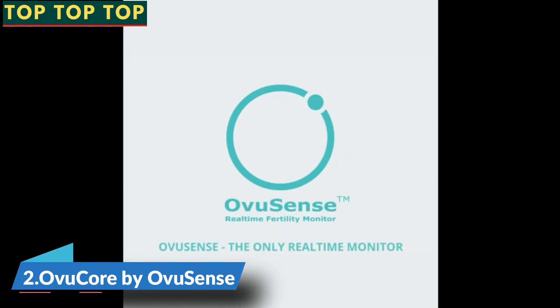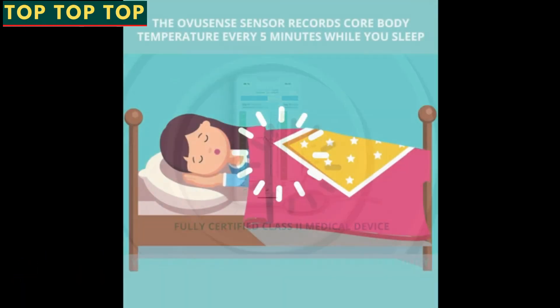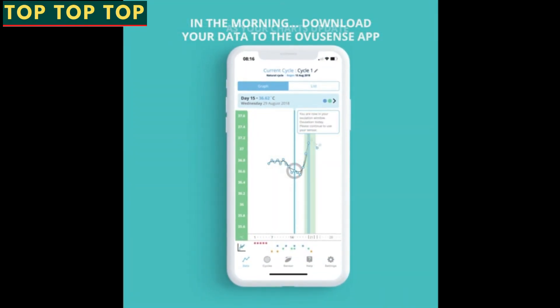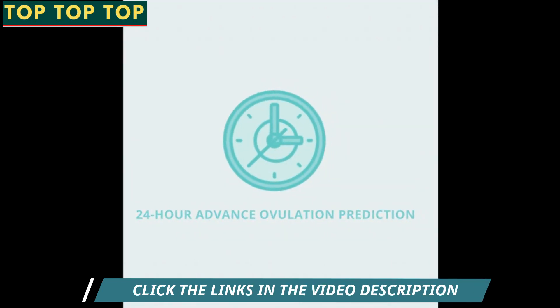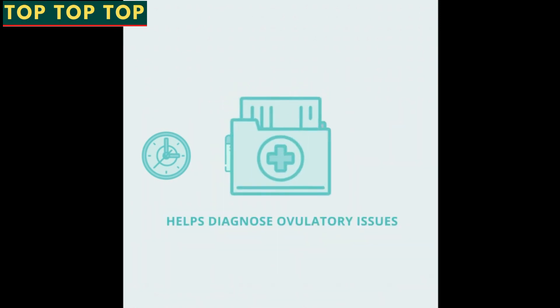Meet Ovusense — the only real-time monitor which puts you back in control of your fertility. The Ovusense sensor records your core body temperature every five minutes while you sleep. As your charts update, the temperature curve shows you the relative level of your progesterone, providing you with your predicted fertile window and your ovulation confirmation all in real time.